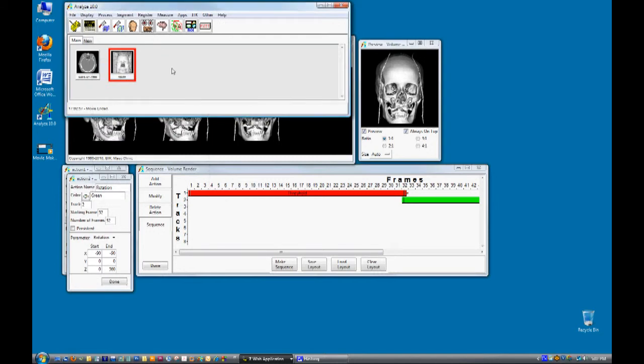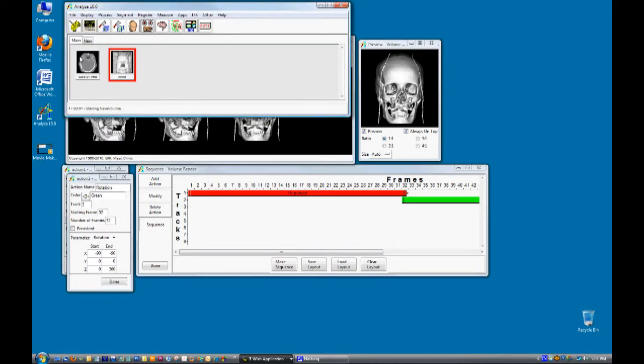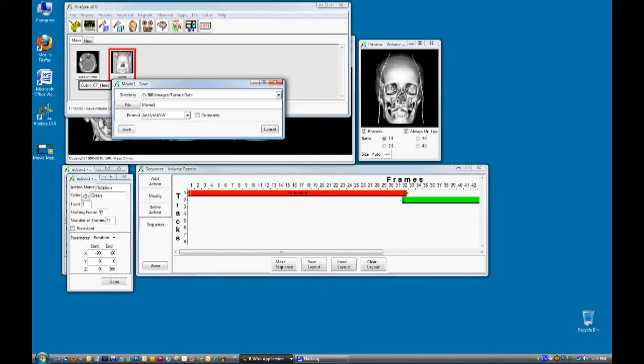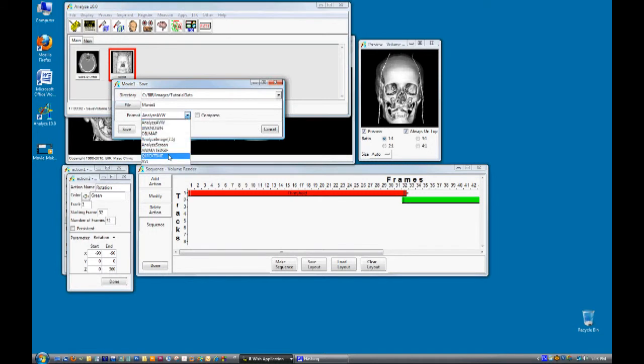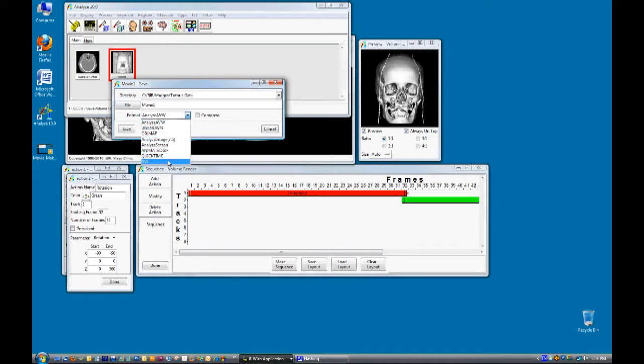To save the movie out of analyze select file and then save. The movie can be saved in the quicktime or avi file formats.